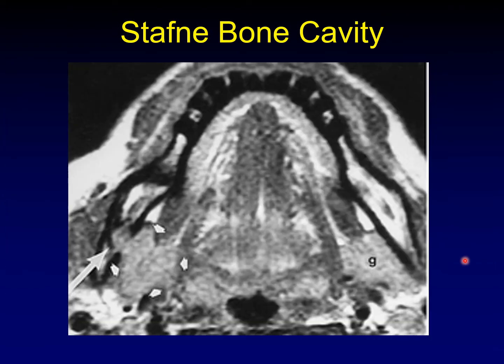Here's an example on MRI where you can pretty clearly see the submandibular gland herniating into the defect. The theory behind these is that they are pressure erosions from a surrounding gland, and it only intermittently herniates into the defect — that's why usually it's filled with fat.